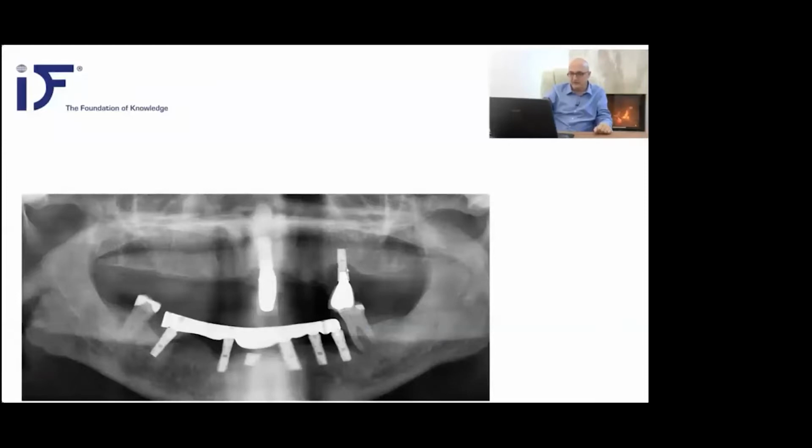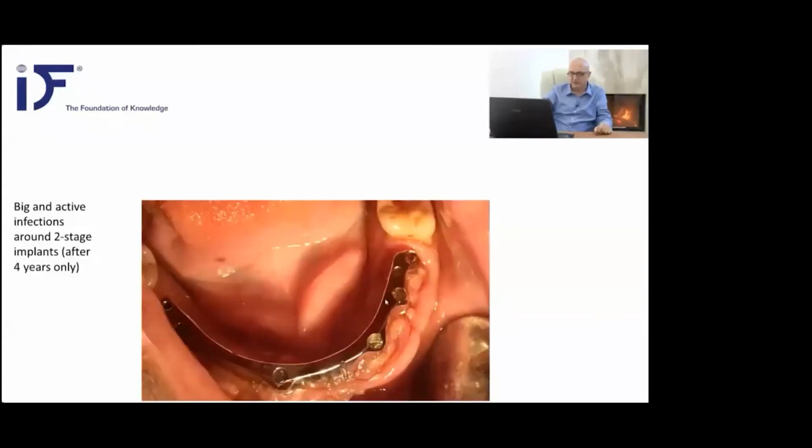Here another case, you see two-stage implant, periimplantitis, two-stage implant, periimplantitis, periimplantitis. This already was cut out, periimplantitis, periimplantitis. You see infection wherever you look. There was a bar on top, and on this bar was some occlusive denture. This is anyway something that I don't recommend, because these removable dentures kind of develop their own atmosphere. I mean, if the patient doesn't take that out for 2-3 days, this can be very occlusive, and this infection is going to go down along the implants. So I don't like to do it.